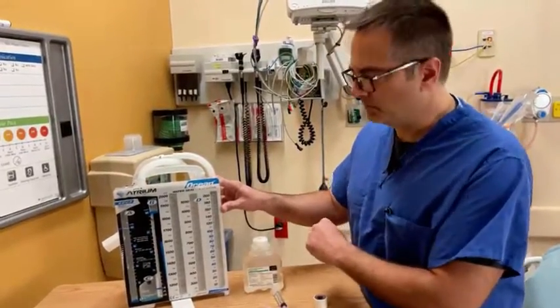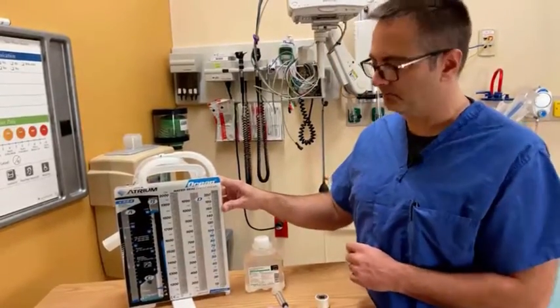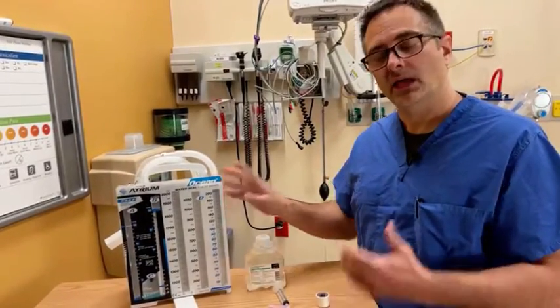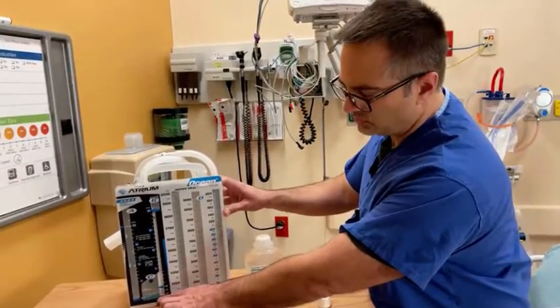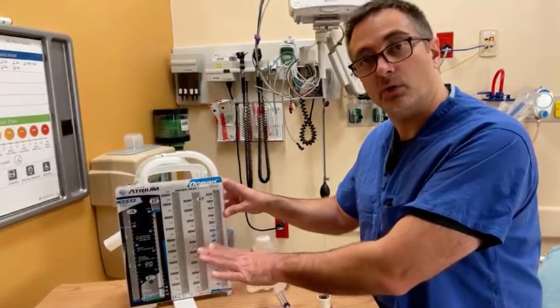After the collection chamber, let's turn our attention to the next chamber over here, which is our water seal chamber. The water seal chamber basically functions as a one-way valve. It allows the escape of air from the chest cavity without entraining it back into the patient. So we would fill this water seal chamber up to the 2 centimeter mark, and that will make our water barrier or water seal.